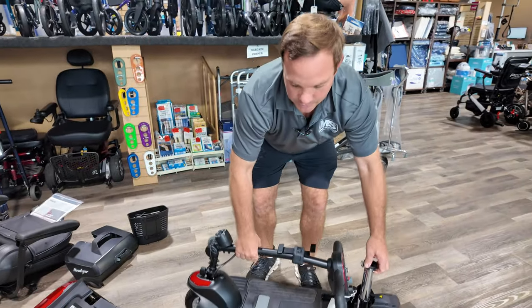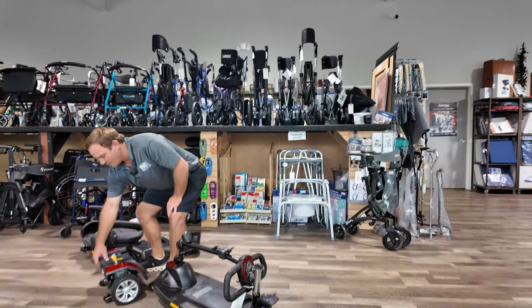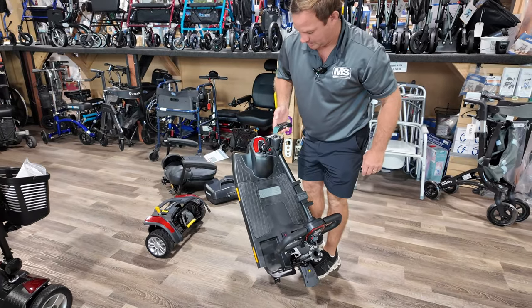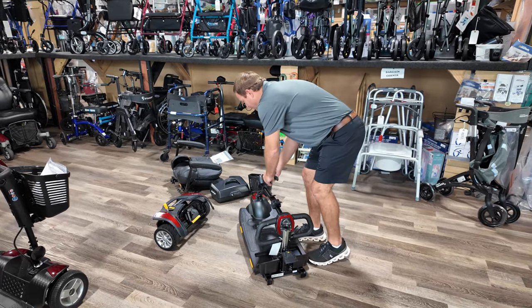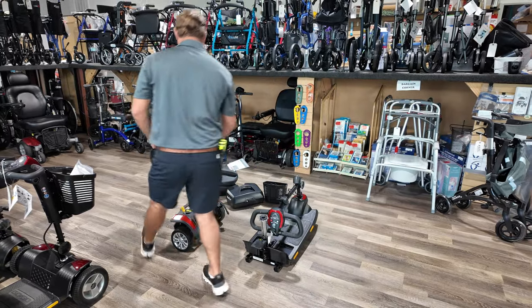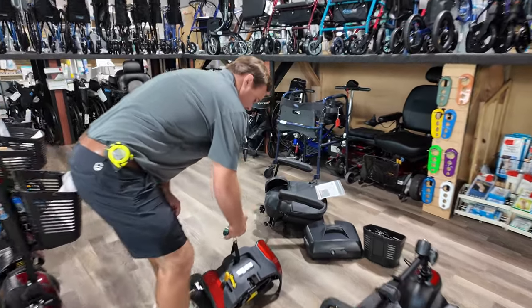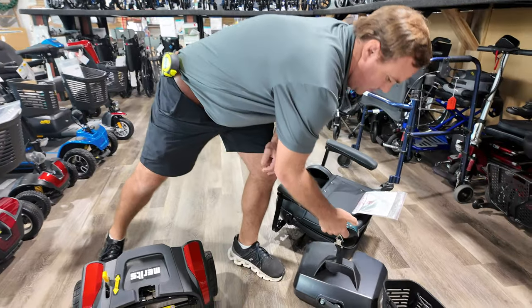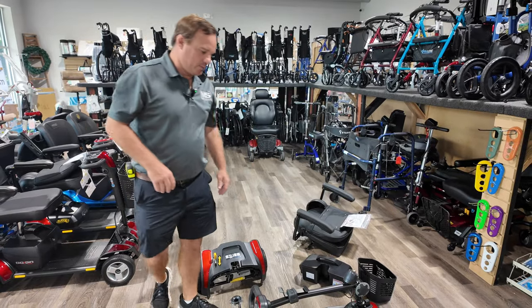This front section is probably about 30 to 31 pounds. The back end has a little handle here. After doing a weight test, it came out to about 23 pounds for the back section and 20 pounds for the battery.